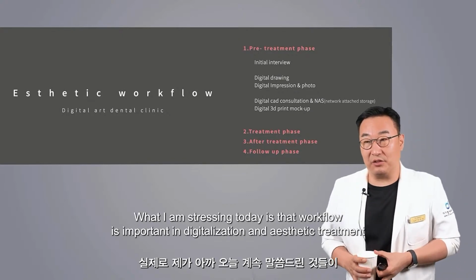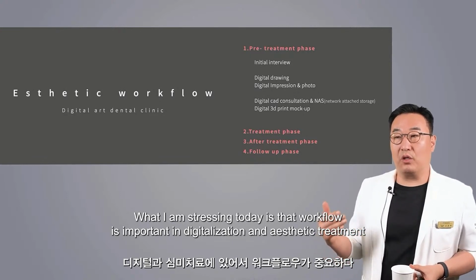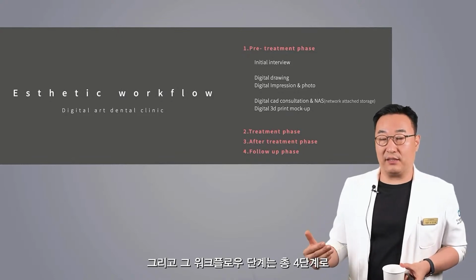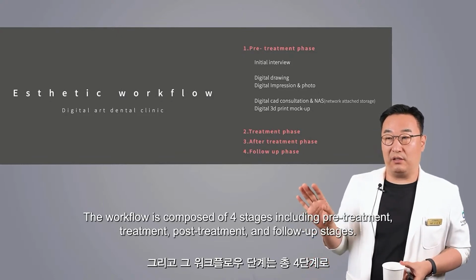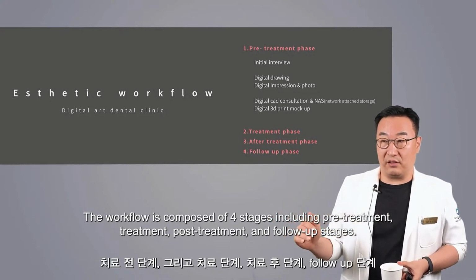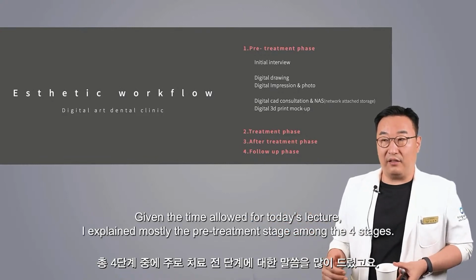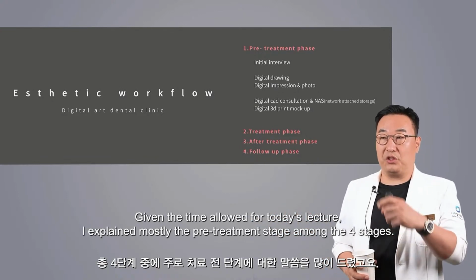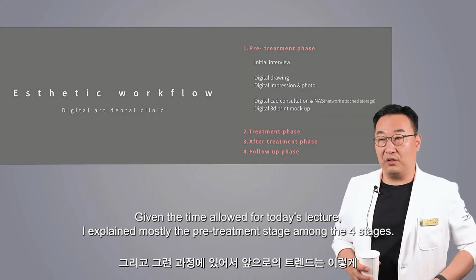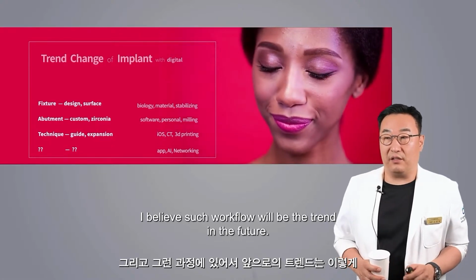What I am stressing today is that workflow is important in digitalization and aesthetic treatment. The workflow is composed of 4 stages, including pre-treatment, treatment, post-treatment, and follow-up stages. Given the time allowed for today's lecture, I explained mostly the pre-treatment stage among the 4 stages. I believe such workflow will be the trend in the future.